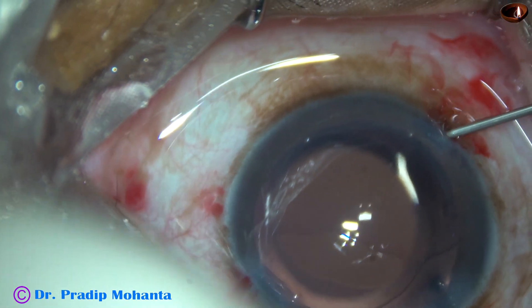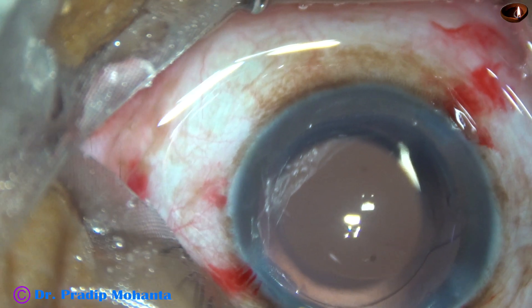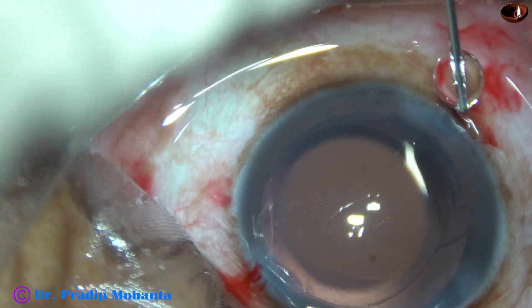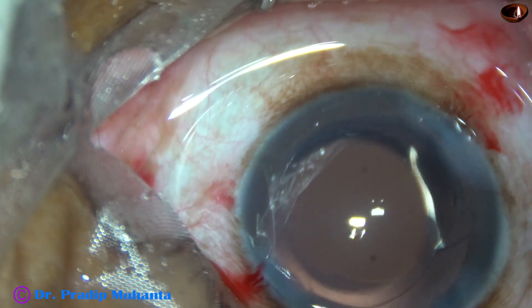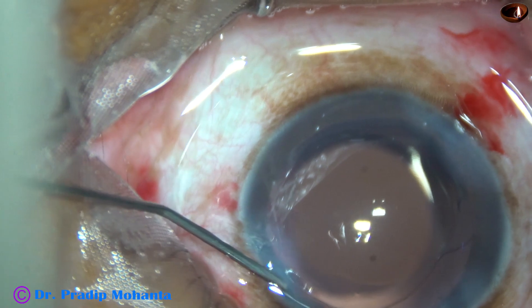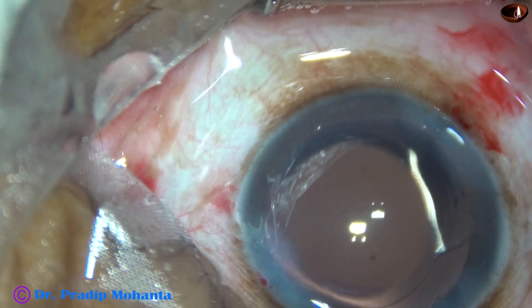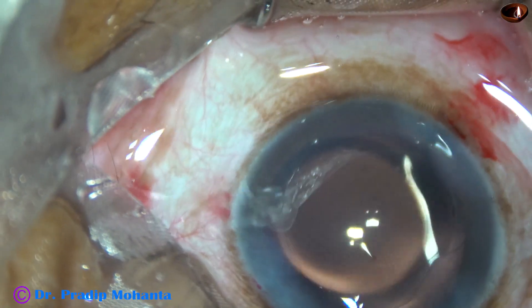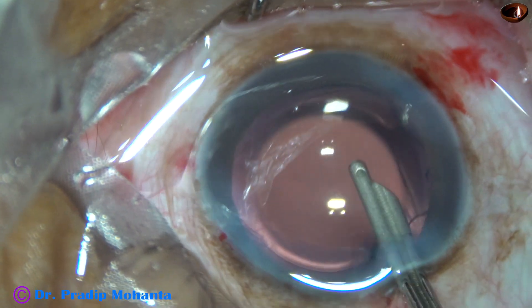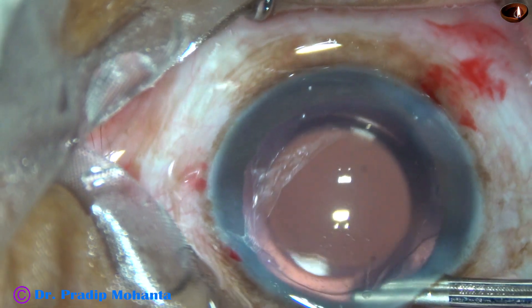This is a bit of moxifloxacin. Now the side ports are closed by hydrating the corneal stroma on either side of the stab incisions. The side ports are closed. Now is the time for a final lavage of the anterior chamber — at this time, any visco sticking to the corneal endothelium is removed. And the anterior chamber is very nicely formed.